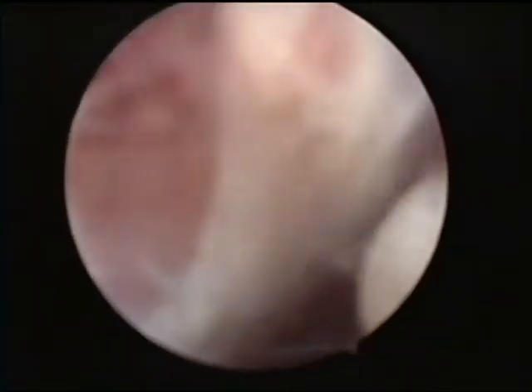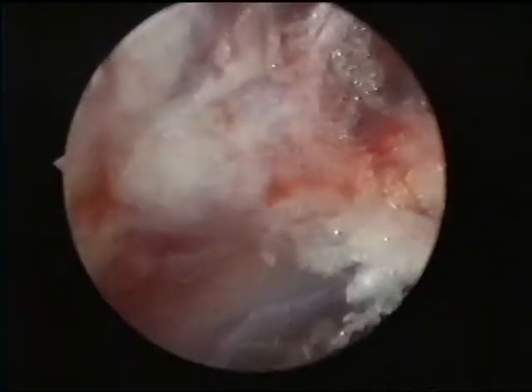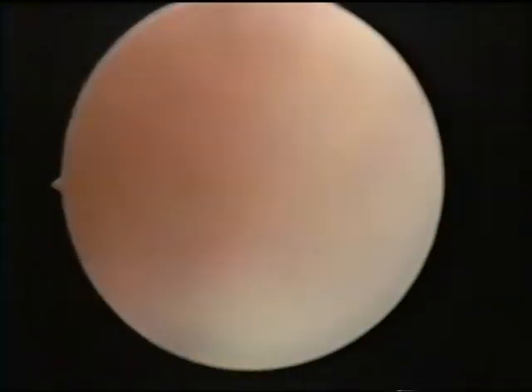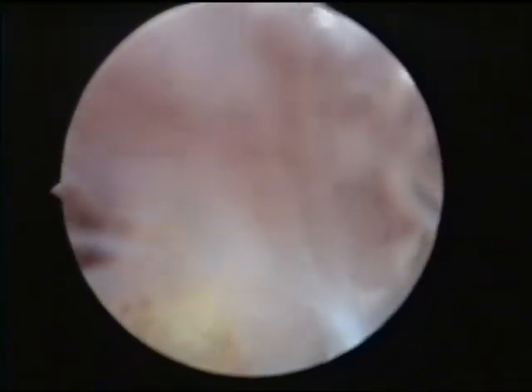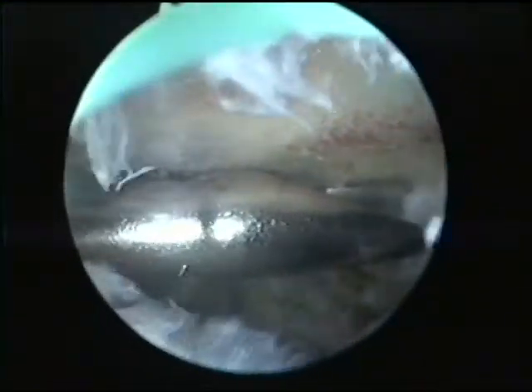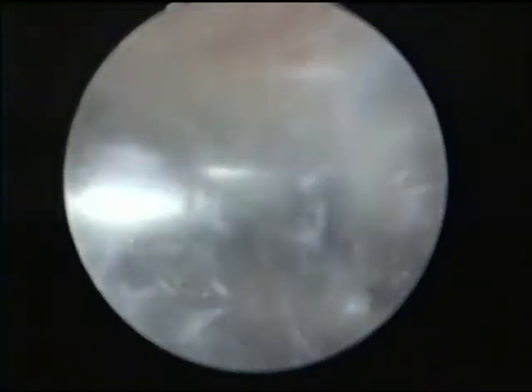Okay, I'm now in the subacromial space, and it looks like lots of bursitis up here and impingement. So what we're going to do first is clean this up. We'll come back on after we have a little bit more done. Let's just take off the undersurface of the acromion that's offending because of the impingement. I take that all the way over to the AC joint.